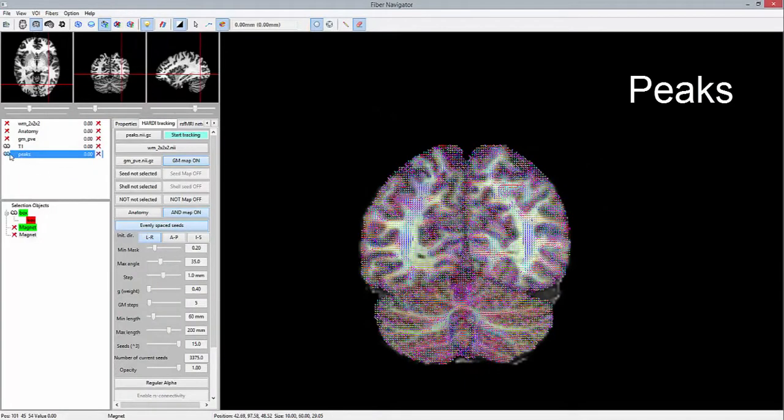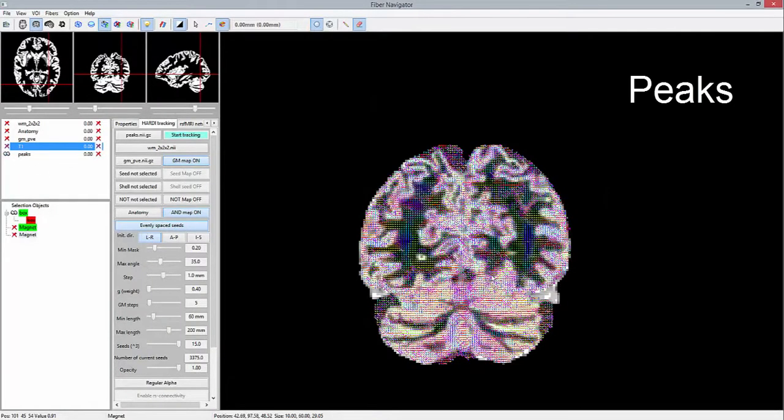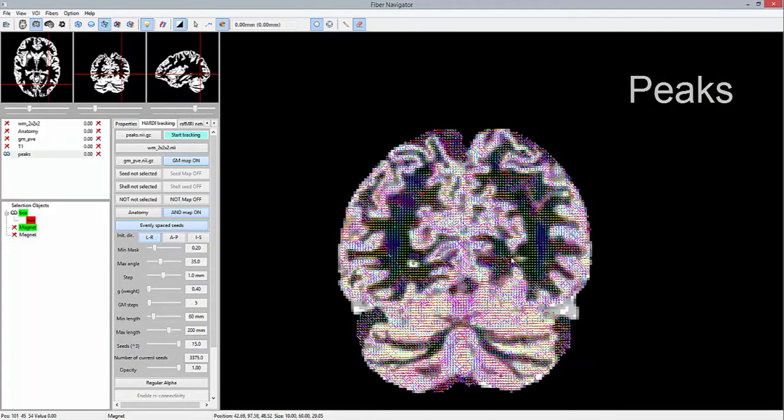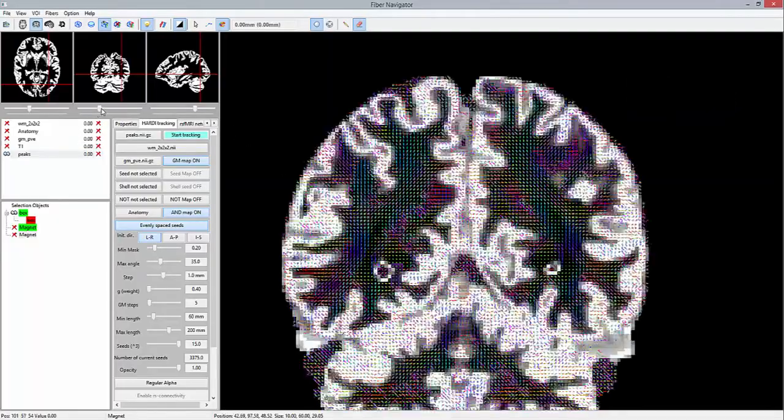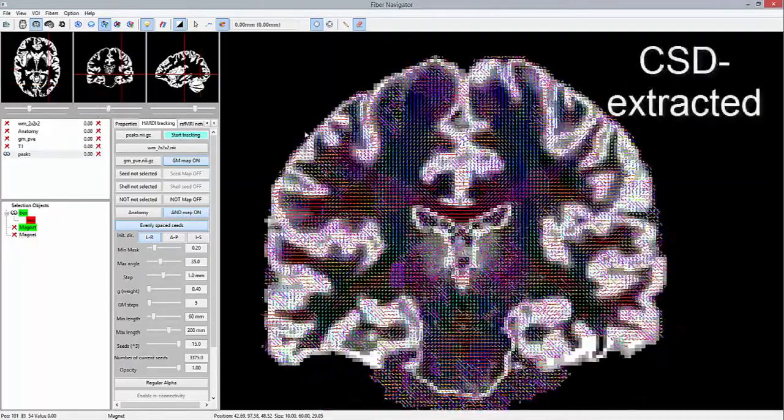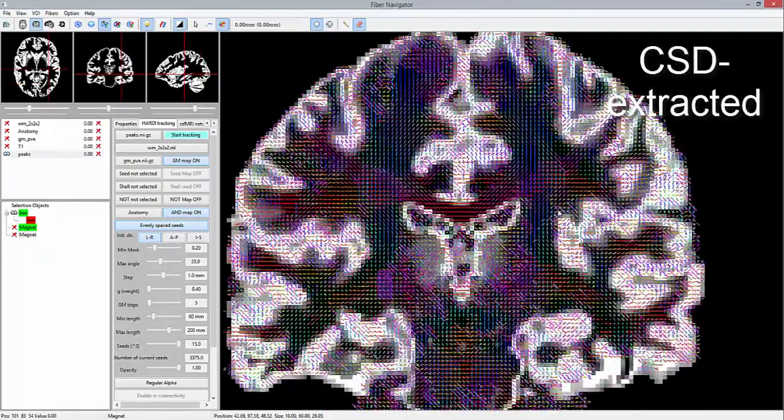Tractography will be performed in real time on a set of extracted peaks from fiber ODFs, but again, feel free to use any local reconstruction technique.